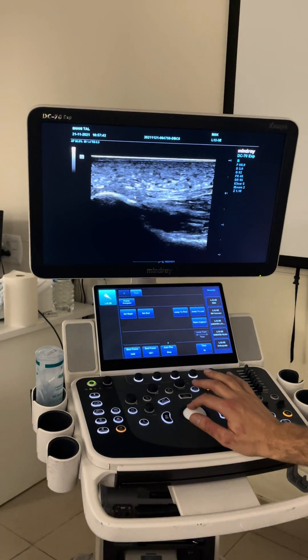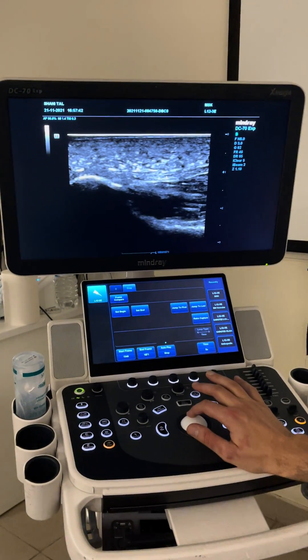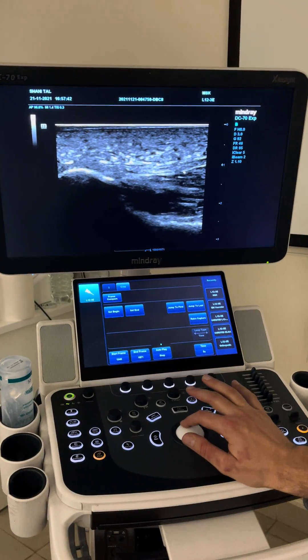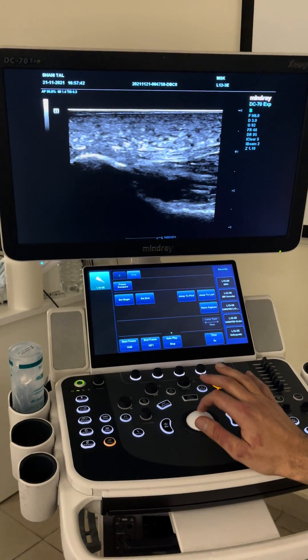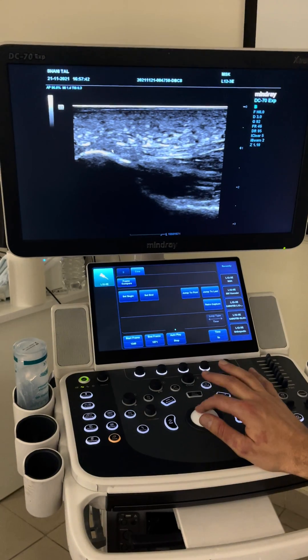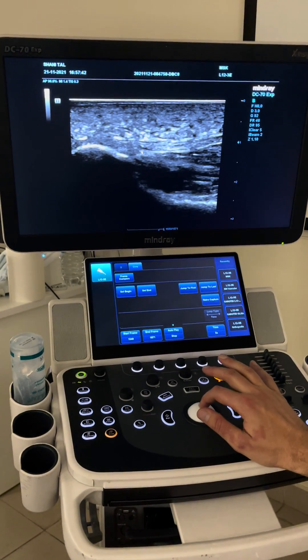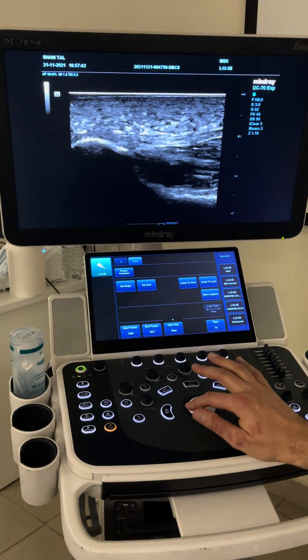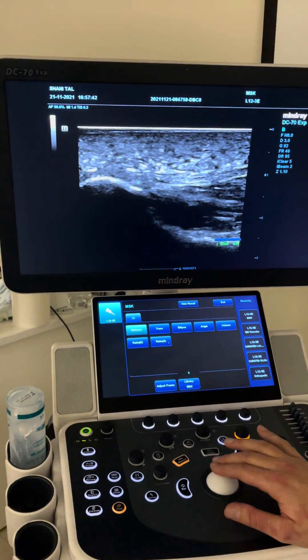Then we have the fascia. Here we can see it more clearly. This is the deep layer of the fascia and this is the superficial layer of the fascia. The superficial layer I can see here and follow downwards. The deep one I kind of lose here, but it's okay — you just follow this line in this direction.